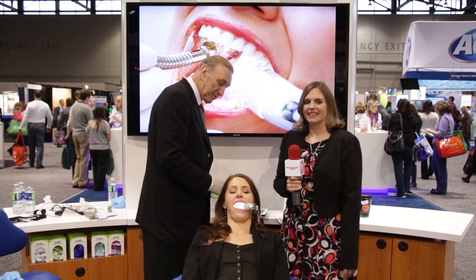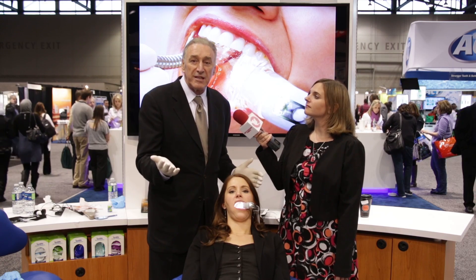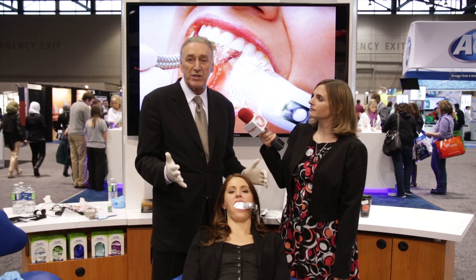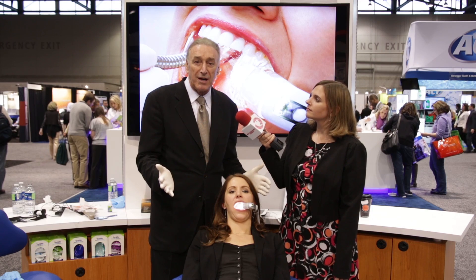That's fantastic. Now, what else do clinicians need to know about the Isolite system? The other thing that's good to know about this is it gives us predictability. We're always predictable about what we can do. We know what our outcome is going to be.